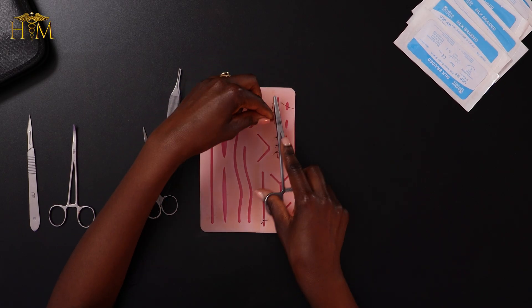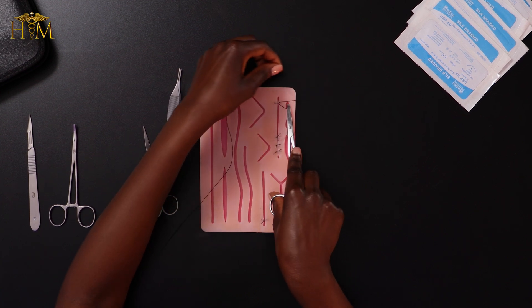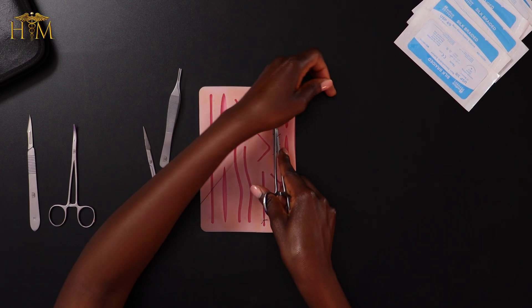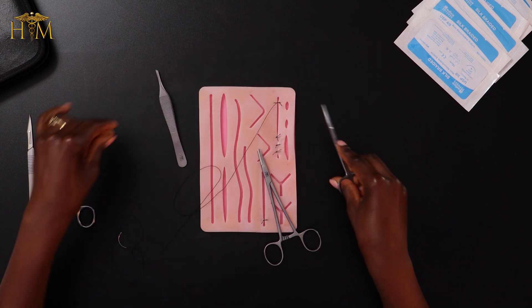Wrap the suture around the needle holder twice, grab the short end of the suture and pull at the same time while crossing over my hands, and then lock the suture. Then wrap once in the other direction and pull whilst crossing my hands over. And one more time, wrap in the other direction and pull whilst crossing my hands. That's the beginning of the running suture, which is exactly the same as the interrupted suture. With the interrupted suture you would cut your suture at this point — but what I'm going to do is only cut the short end, and leave the long end intact because I'm going to use that to do the rest of the running suture.